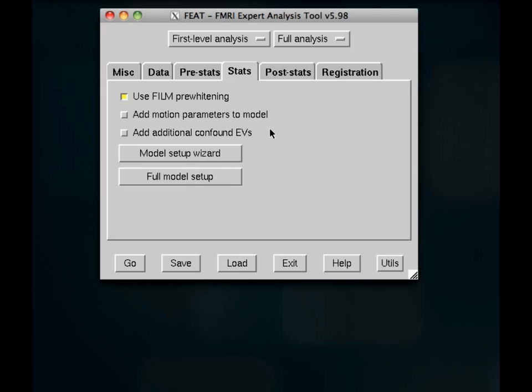And if you have a text file which might have timing information for any conditions of non-interest or nuisance variables, you can add that in here. I'm going to leave those unchecked for now because the subject that we scanned in this experiment was a pretty good subject and didn't move too much.